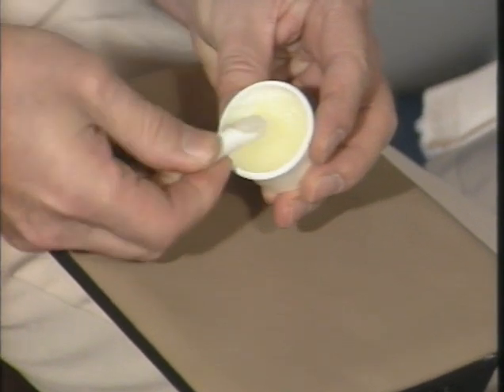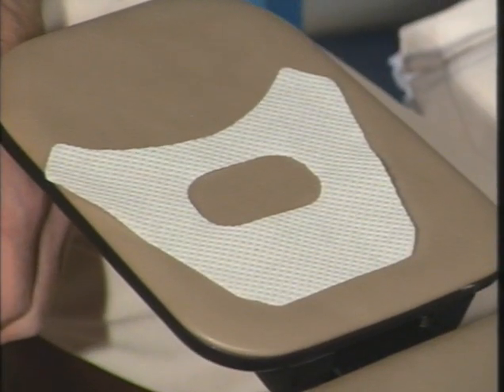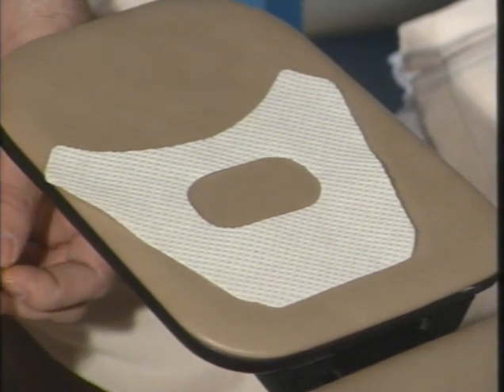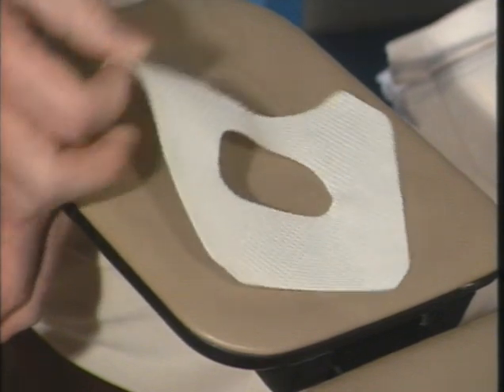the way, but that can give an additional problem because the friction of the dam against, for example, the corners of the mouth can eventually cause a sore area there. So before the dam is actually placed, it's obviously useful to use something like Vaseline to put around the corners of the mouth. Additionally, you can use a soft absorbent napkin. It obviously adds to the patient's comfort and it's very useful for mopping up saliva around about the corner of the mouth and for wiping away the Vaseline when the rubber dam is removed.